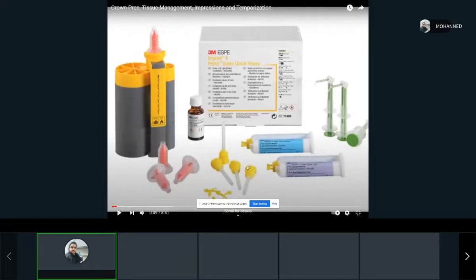So the light body, we have a smaller diameter mixing tip, which is usually yellow. The heavy body, we have a larger diameter, which is usually teal. And we use the teal one also for byte registration. Again, we have a handout for that in the lab. You're going to hold these things and work with them. And this is another type of system. It looks like the digits, but you can use it with your existing light body. Anyway, let's take a look.